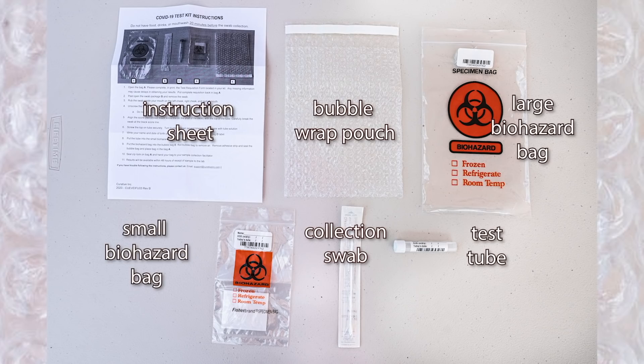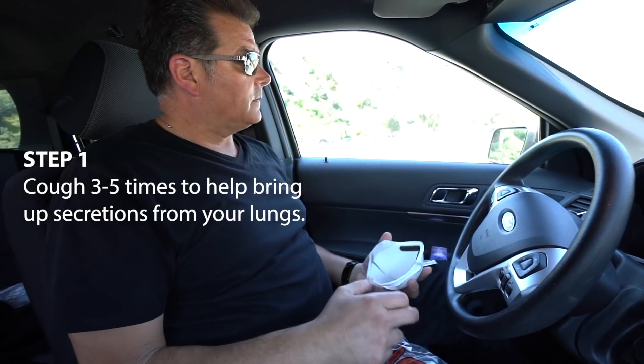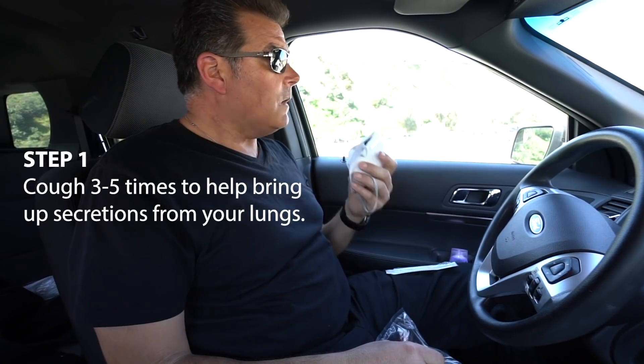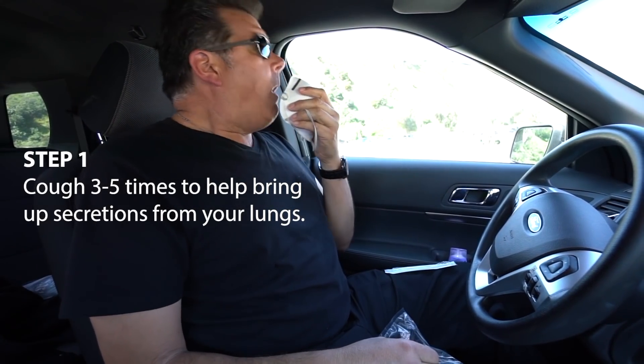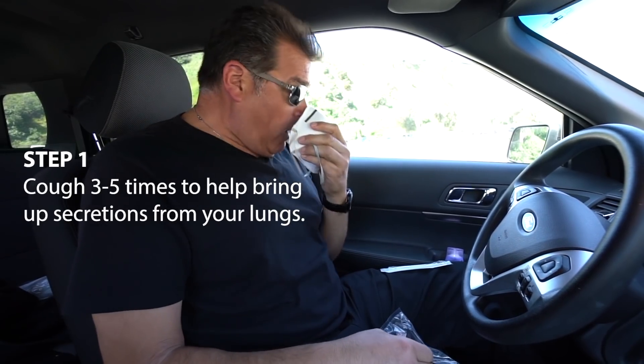These items will ensure the safety of the sample during transport. Step 1: Before proceeding with the following steps, cough forcefully at least 3-5 times in an effort to bring up secretions from your lungs. This will greatly enhance the quality of the sample that you will be collecting.